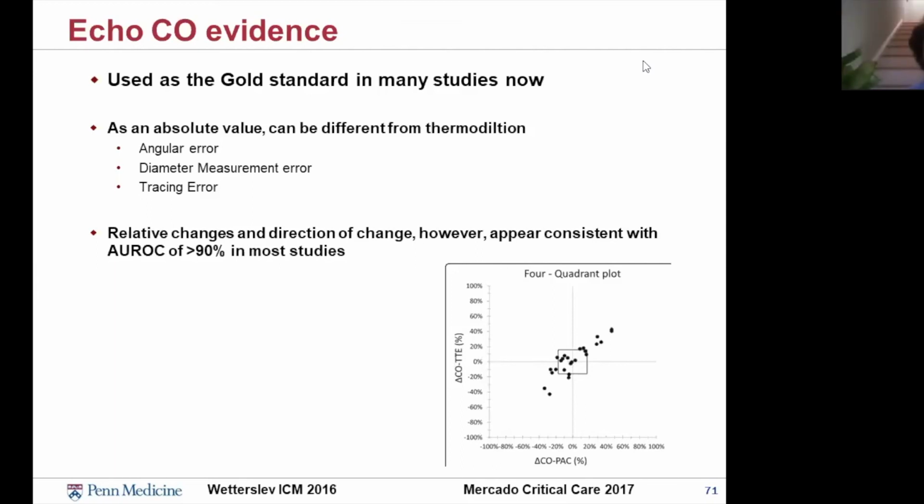I'm excited about it, but I think the evidence is not there yet. I've only seen one study using renal Doppler, and it was just to predict whether a patient was going to respond from a creatinine measurement standpoint. So I don't think we're at a place where we can use renal Doppler alone to evaluate patients in shock. But I'm excited to see, as new studies come out, whether that changes. Yes, very good. So we still have to integrate many other parameters and images, right? Exactly.